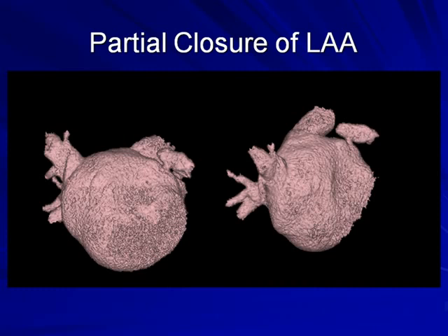Let's talk about partial closure of the left atrial appendage. This is a patient who had had mitral valve repair and had a suture closure of the left atrial appendage. This is a pretty common finding. A lot of people say, well, it's ligated, we don't have to worry about it at all. Turns out that's not true.